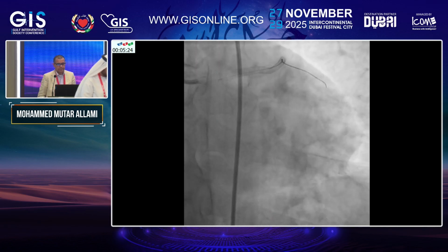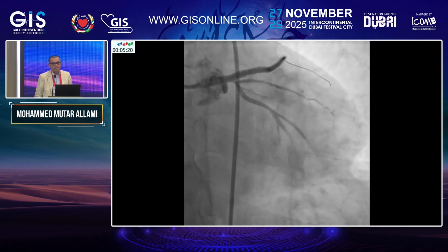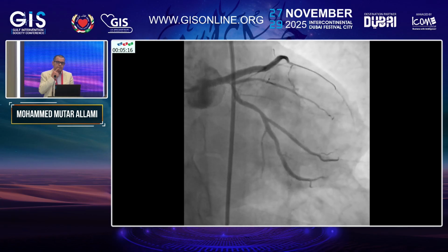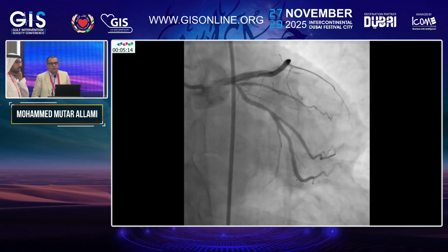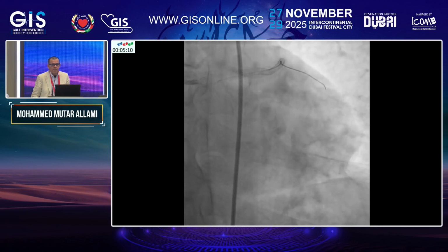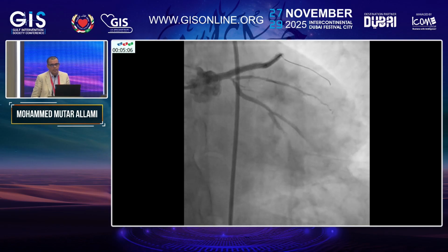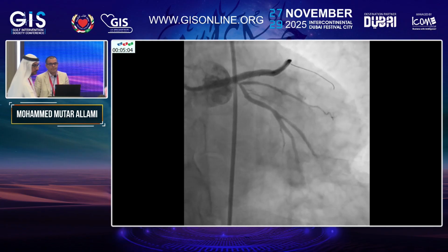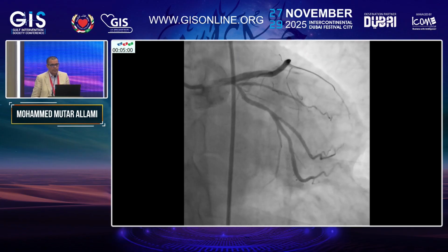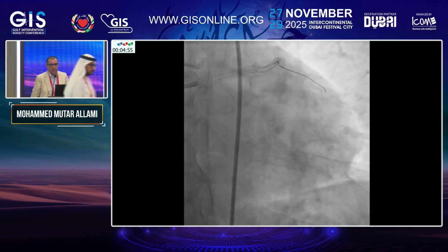The question, before the suggestion, is why this part of the stent was in the aorta. Was it deliberately left in the aorta? Then the problem starts. Number two, I think the circumflex is a very severe pinch, so that must be tackled. It may cause a lot of pain in this patient. Exactly, I agree with you. The circumflex is significantly pinched, and it seems to be a big circumflex supplying a large area of the myocardium.